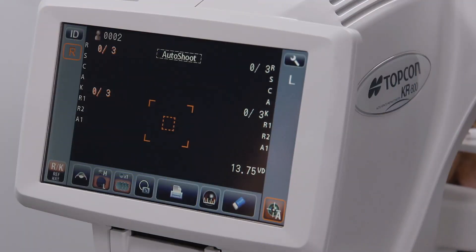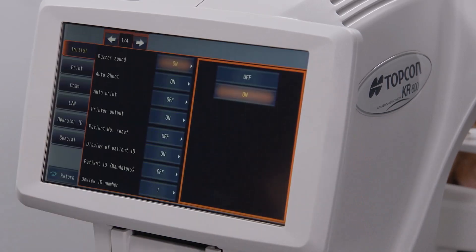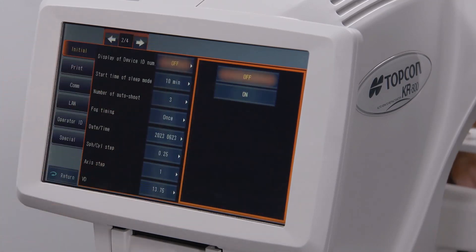To access the settings menu, click on the wrench icon at the upper right of the screen. This will reveal a new window with a series of tabs on the left. The initial tab contains several pages of settings. Different pages can be accessed with these arrows.